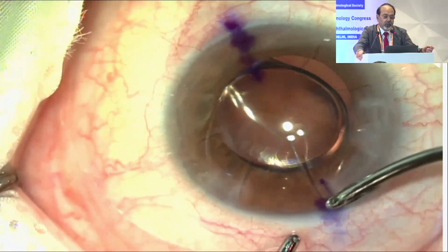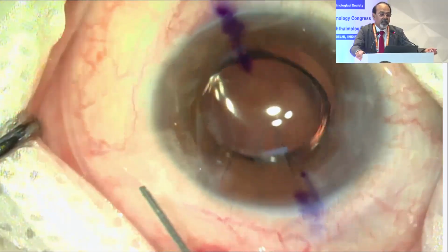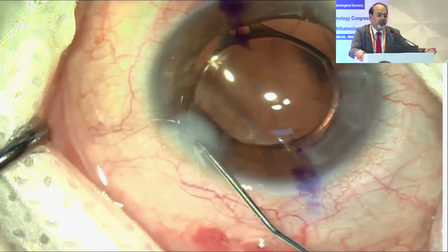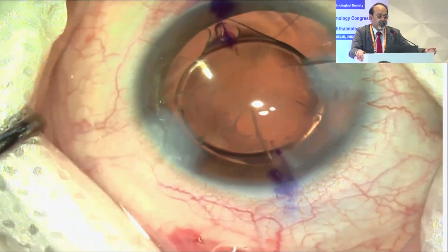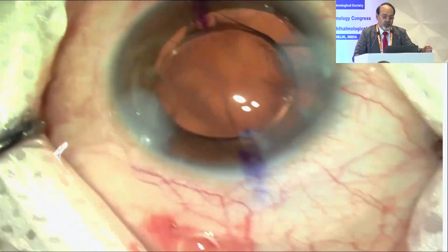And then you hydrate, and you ascertain that the lens is situated or placed at the angle which you wanted. As you can appreciate here, the axis is correct, and once this is achieved, the procedure is over.